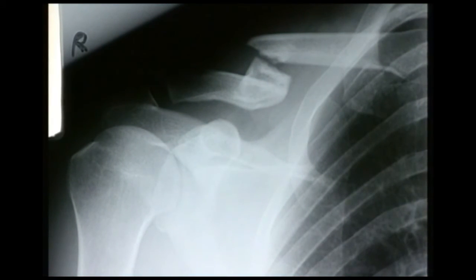This gentleman was riding his bike and was hit by a car, landing on the point of his shoulder and sustaining this injury. The force went up the length of the clavicle and resulted in a fracture with some comminution — at least one fragment at the fracture site. Clavicles heal reasonably quickly in most cases, certainly in children. Midshaft fractures of the clavicle have a significant rate of non-union — about 10% — and I would warn the patient of that risk. For the 10% with non-union, surgical intervention would be considered: bone grafting and stabilization with a plate or other fixation. Treatment is a broad arm sling initially under the clothing in the first week, then out of the clothing for another 2-4 weeks until pain settles, mainly for pain relief and to take the weight off the shoulder.